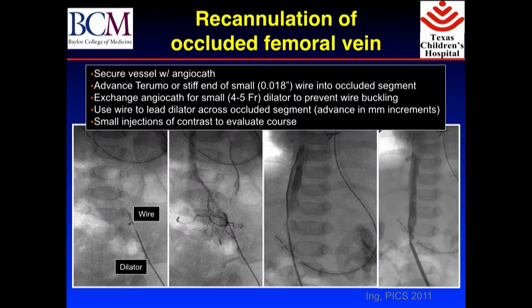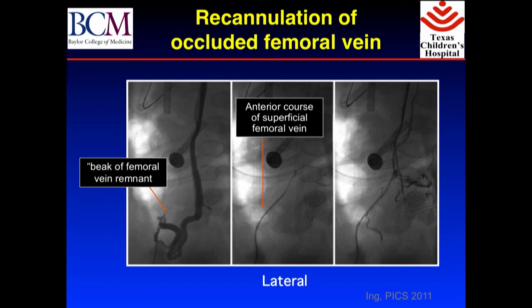So of course, we can go after this example of the same kid. We're able to find little wires to pass right through, and we get back to the vessel. On this panel, far on your right, you see that the sheath is now up in the vessel. Now everything's wide open, and of course, that's where we want to put stents in to open it up to that size. You can see the AP view. Here's the lateral view of that same little beak, and you see how we make our way back up into the femoral vessels.